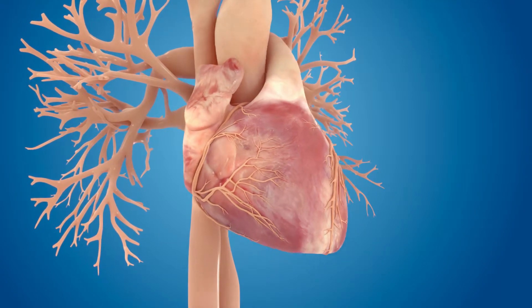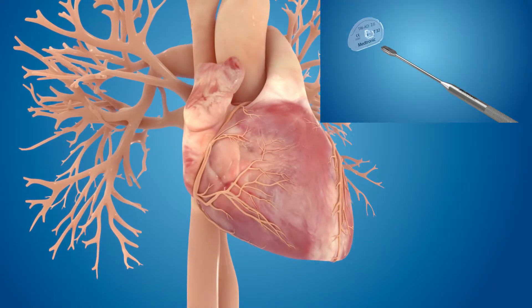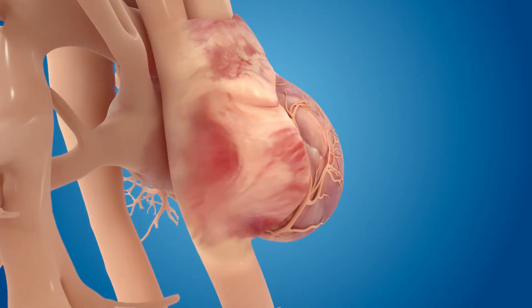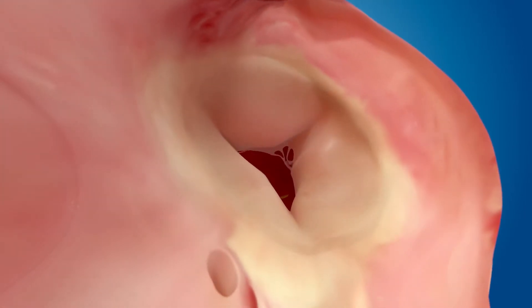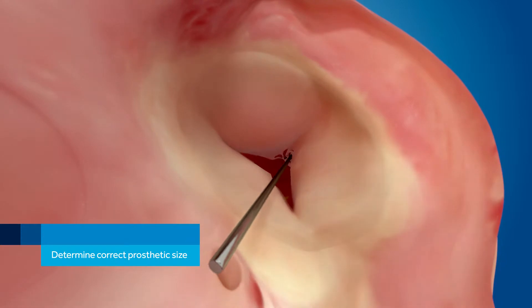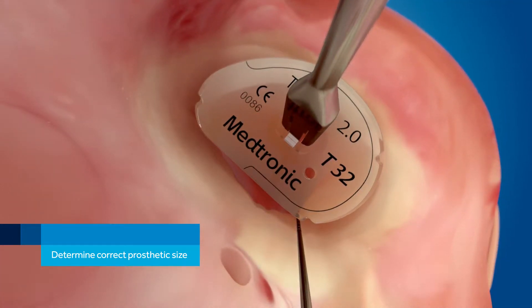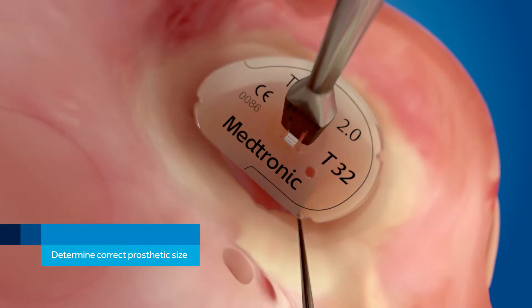Let's take a closer look at the implant procedure using the Triad 2.0 Band. In a heart with a dilated tricuspid annulus, we must first determine the proper size of the band. Note that the new Triad 2.0 Sizer includes a pictogram of the band's profile on the annulus.